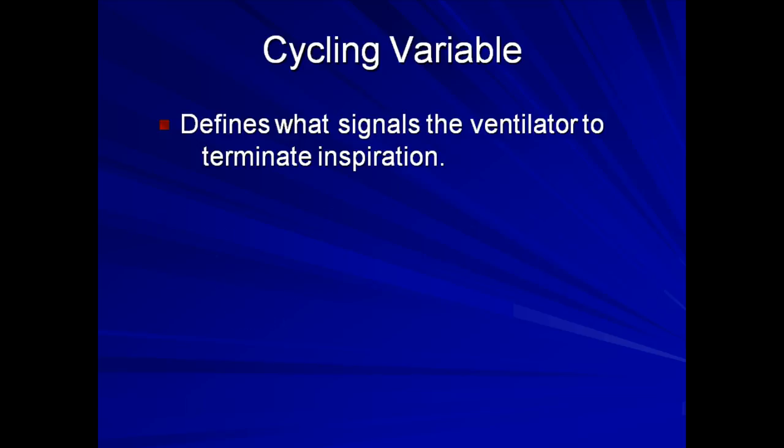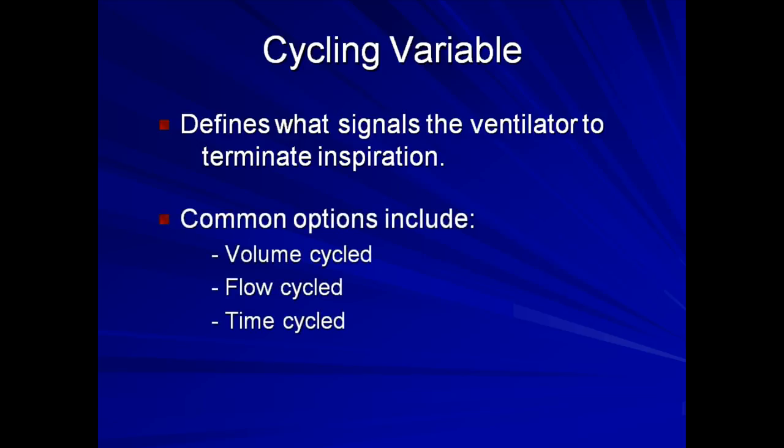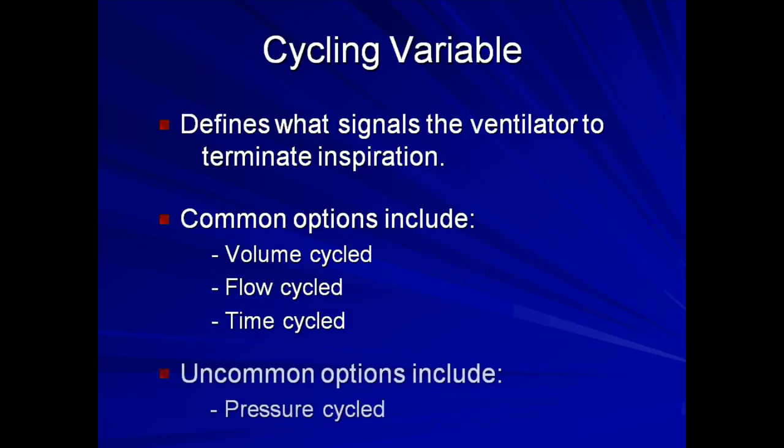For example, with volume cycled ventilation, the ventilator will cease inspiration after a preset volume has been delivered. With flow cycled ventilation, the ventilator will cease inspiration after airflow drops below a preset threshold, typically approximately 25% of peak flow. Ventilators can also be time cycled or pressure cycled.